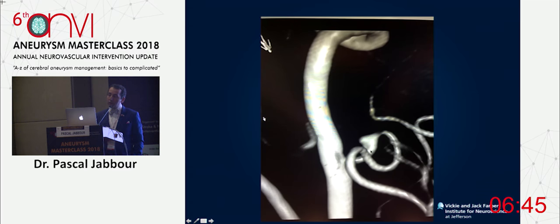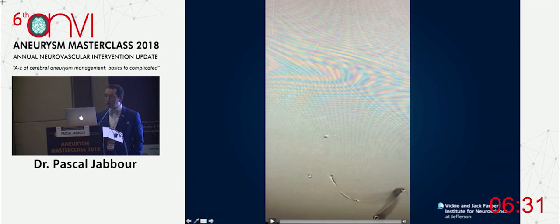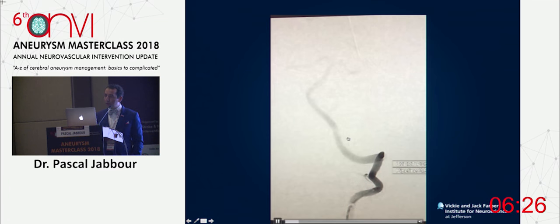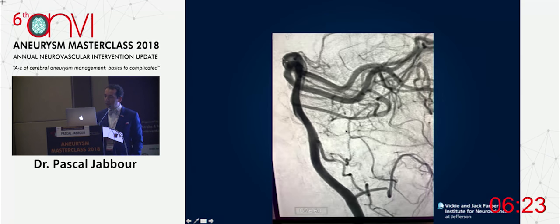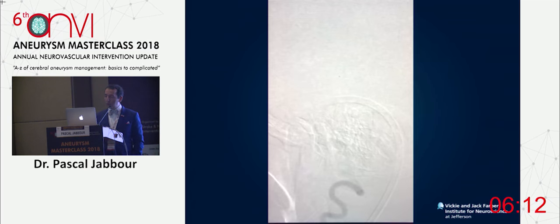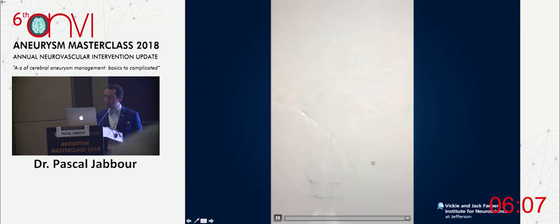For example, one of those aneurysms: proximal PICA. This was a ruptured aneurysm. It is controversial to use a flow diverter or stent in ruptured cases, but if you follow the protocols and don't have any other option, you can do it. In this case I don't think we had a better option — most likely a dissecting aneurysm. This is the six-month follow-up angiogram showing the vessel is completely reconstructed.